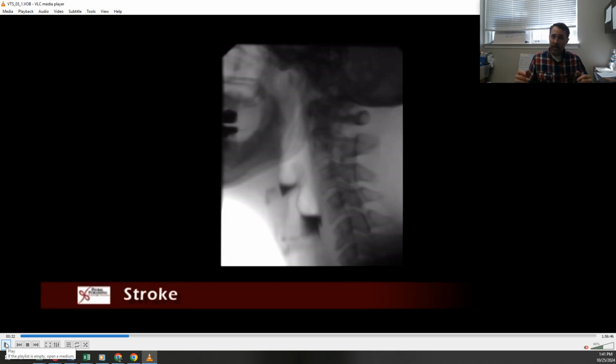A long delay or an absent pharyngeal swallow, or there's a very weak pharyngeal swallow and we're just really not able to see it when it happens because there's just not much visually to show us that is the pharyngeal squeeze.